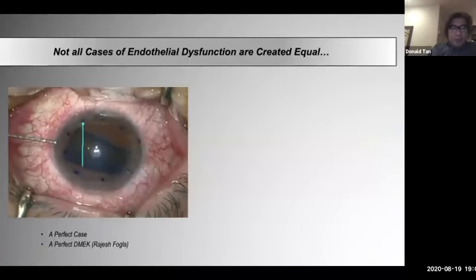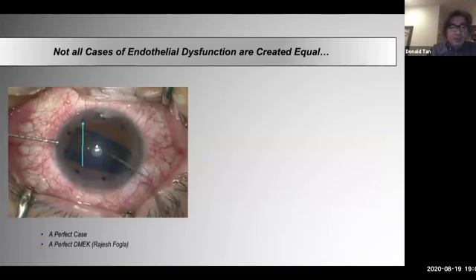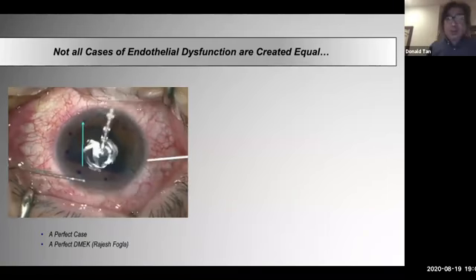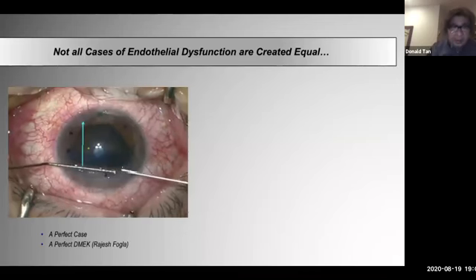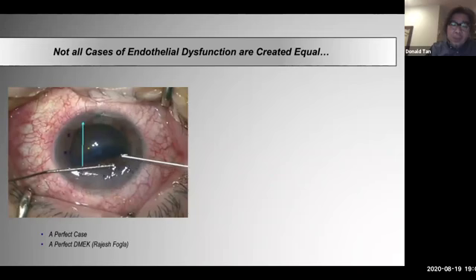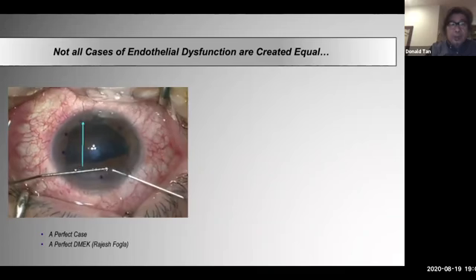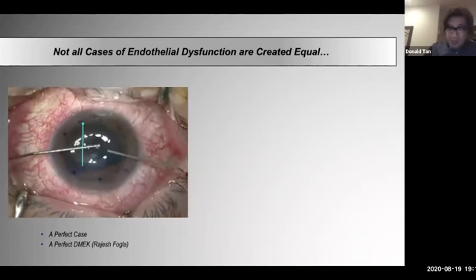This is my good friend Rajesh Fogla from India, and I think this is the nicest video I've seen of a perfect case and a perfect DMEK. He did this as live surgery for the Asian Corneal Society. Very cool. He did it in about 5 minutes, and very good tapping technique. And it takes a long time to learn this technique. The advantage here is that the anterior chamber is normal. The view is pretty good, and there's no peripheral anterior synechia. The pupil is small. A perfect case.